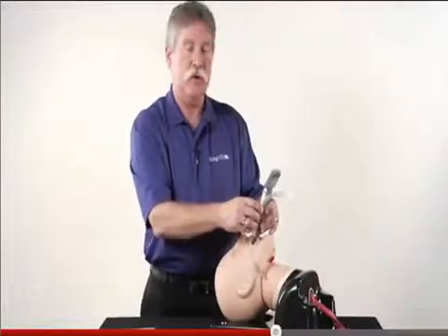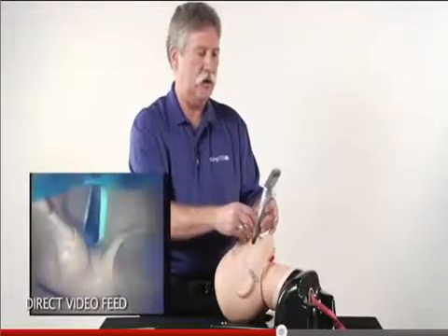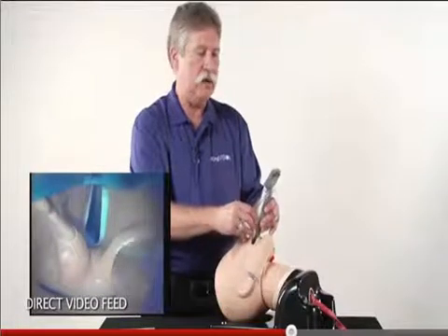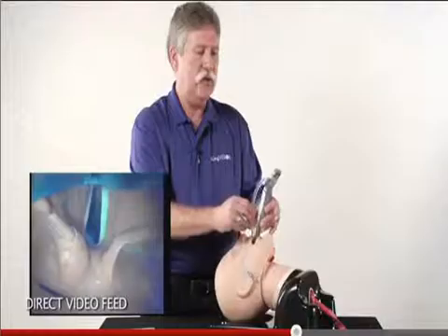And actually, the closer you get to the vocal cords, the more likely you are to run into the right border or the right arytenoid. And if that's the case, then what you're going to have to do is retract the tube, and you'll have to twist it even further to the left to advance it into the laryngeal vestibule, and then rotate it back to the normal position to advance it into the trachea.